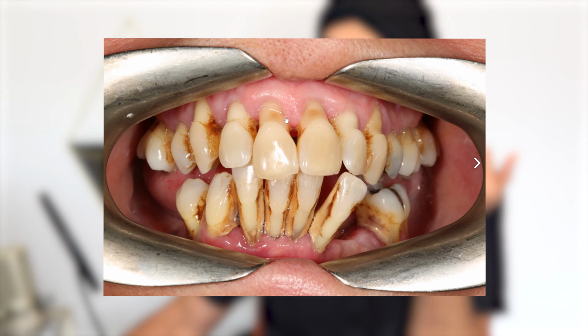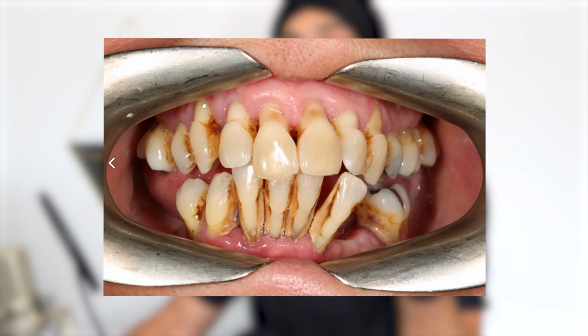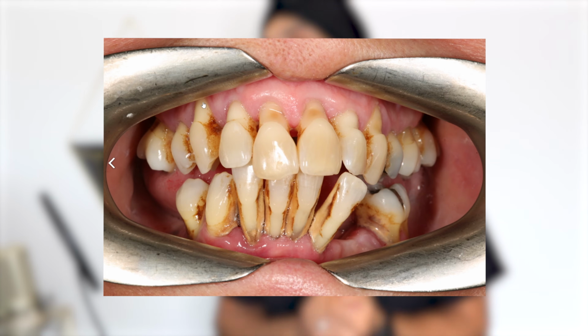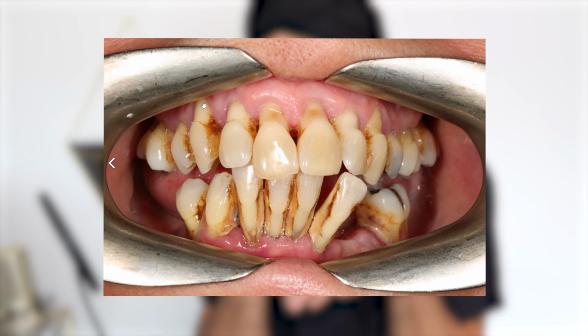When the patient was just smiling, we could see about this much gum. If I take the gum up another 5 to 6 millimeters up here, we are going to be safe and clear of the transition line showing when the patient smiles really widely. So remember that we want to take it up 5 or 6 millimeters.